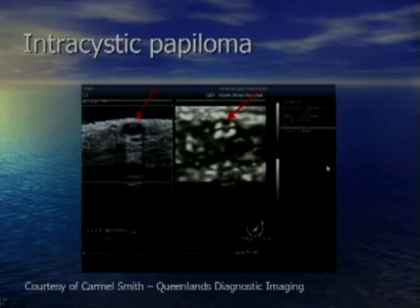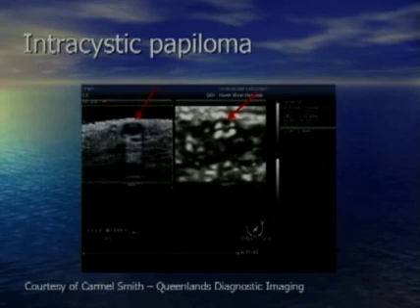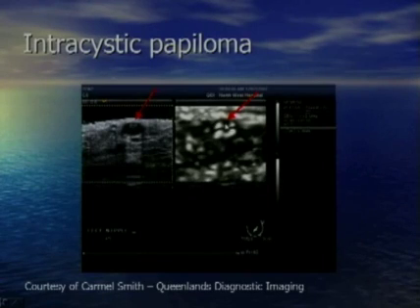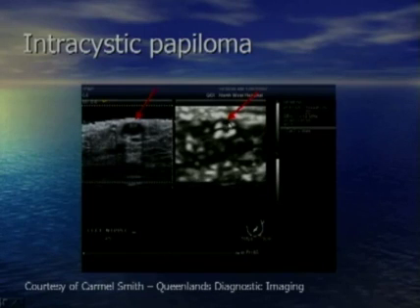We were concerned whether the bullseye artifact could hide a cystic neoplasm. This case — courtesy of Carmel Smith from Australia — shows the smallest solid component in a cyst I've seen: a 2 mm intraductal benign papilloma. The solid component, the papilloma, appears smaller on the elastogram, but you can clearly see that solid component within the cyst artifact. We've seen many such cases and feel very confident that if there is a solid component in a cyst, it will show up as a hard area within the bullseye artifact.